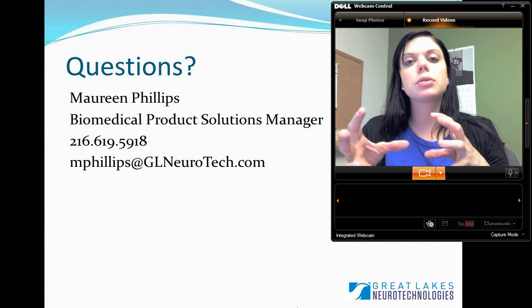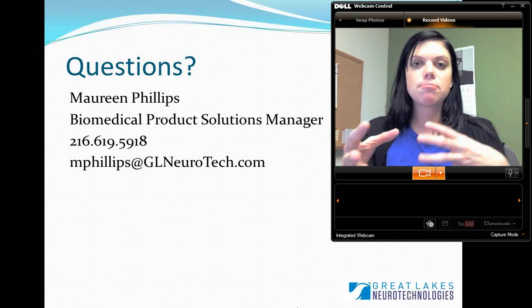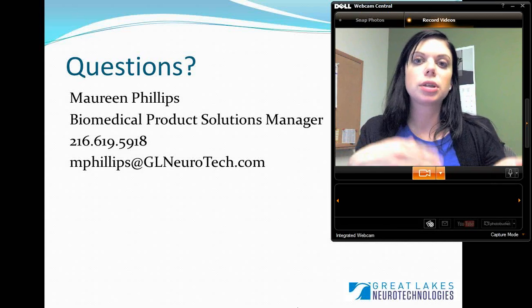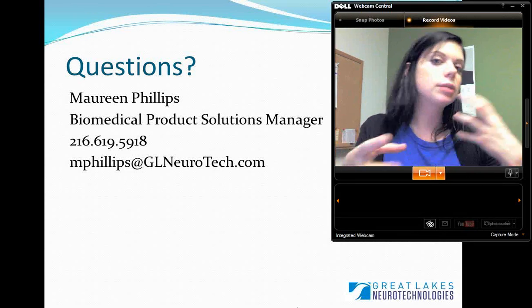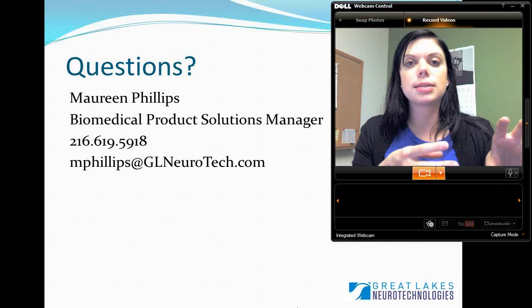So what you can do is configure those 8 channels on the BioRadio to be specific to that. Let's say maybe you only need 2 channels of EEG, then you can use those remaining 6 channels to record the other biopotentials and physiological signals. And you can, again, mix and match depending on what you feel is necessary.